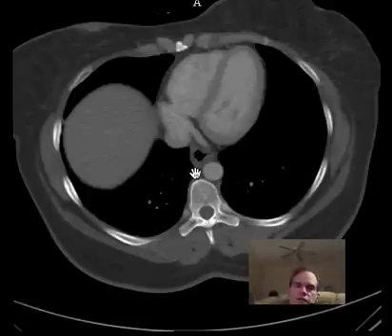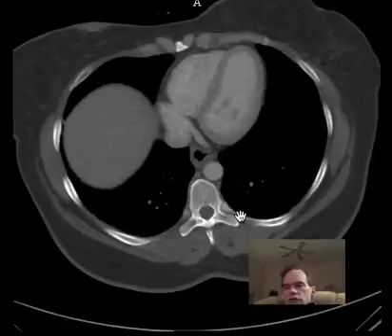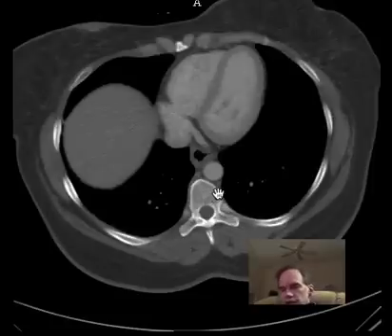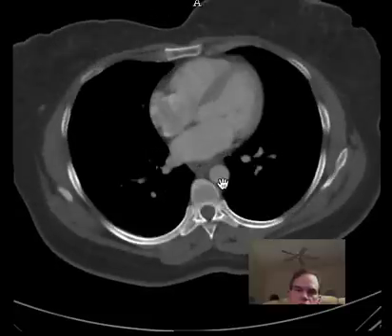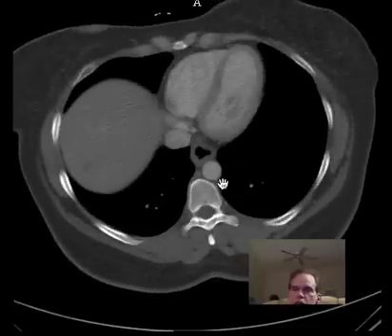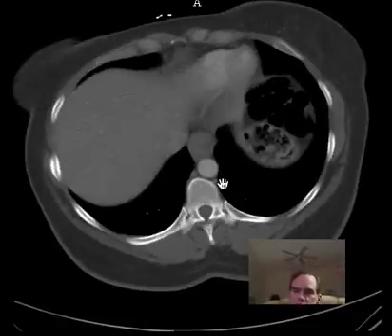This is the azygos vein, and this is the hemiazygos vein. These are structures that afford some additional drainage pathway for the structures below the diaphragm. Blood is coming up from below the diaphragm in the azygos and hemiazygos veins, and they course all the way up — though we don't go up high enough here to see that they empty into the SVC.